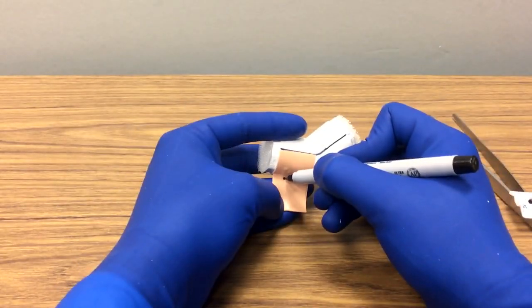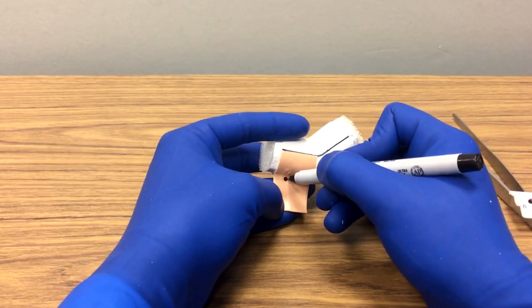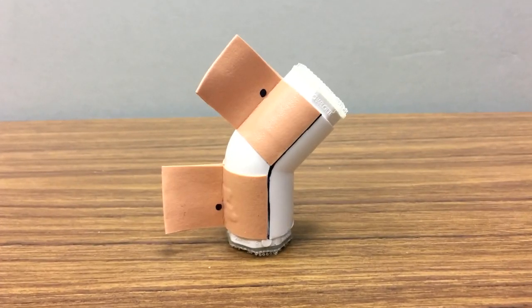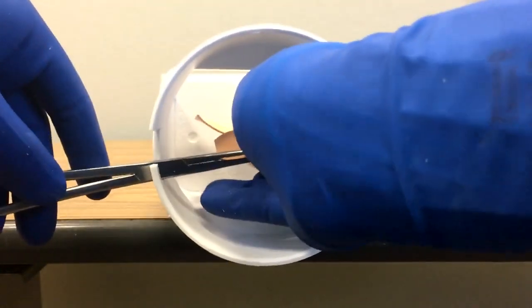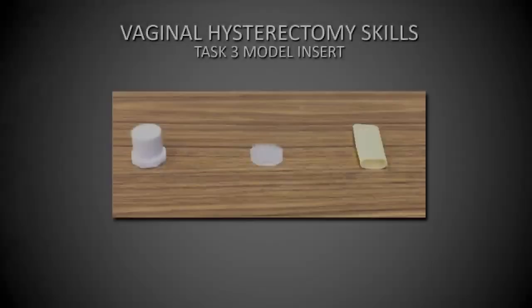A 2 millimeter dot is drawn adjacent to the elbow, 8 millimeters from the edge of the tape. A second piece of tape is placed on the other side. For tasks 1 and 2, the hysterectomy clamp is placed at the edge of the dot, and the insert is placed in the base for either right or left-sided suturing.